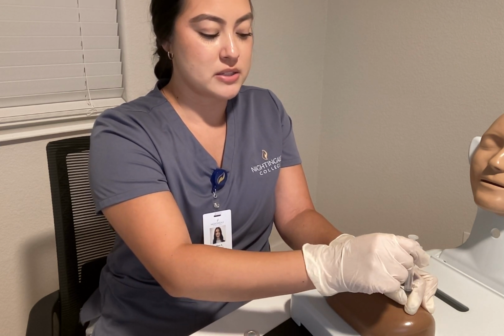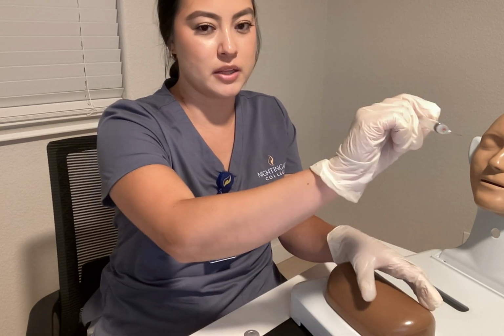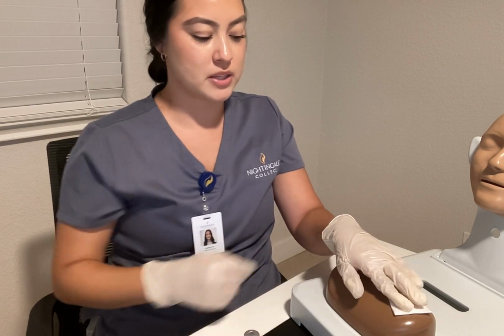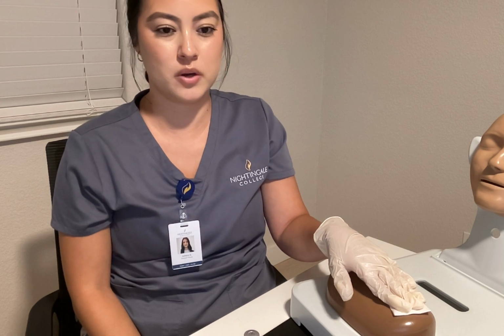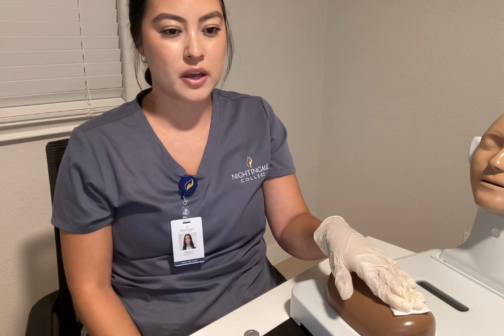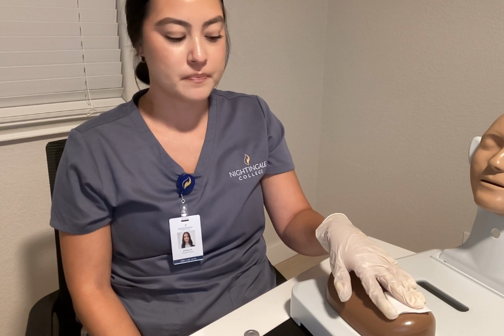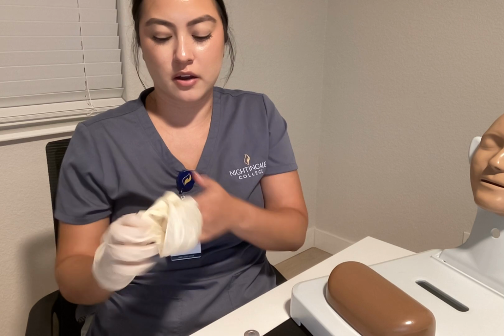Okay, once that 10 seconds is up, we're going to carefully withdraw. We are going to immediately put this into the sharps container, and we're going to place a gauze over the injection site. You do not want to massage the area. You can apply a bandage if the patient requests. Everything looks great. We'll take off my gloves.